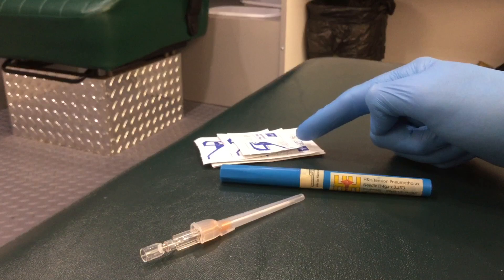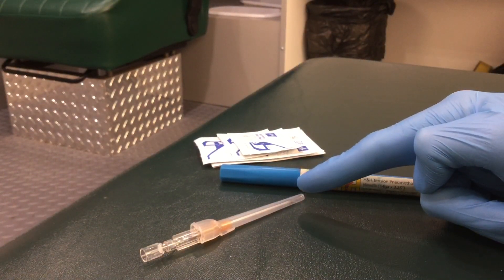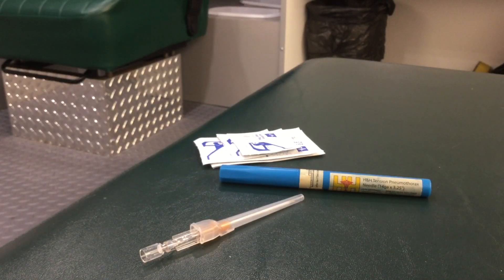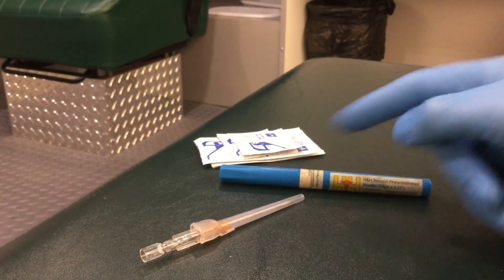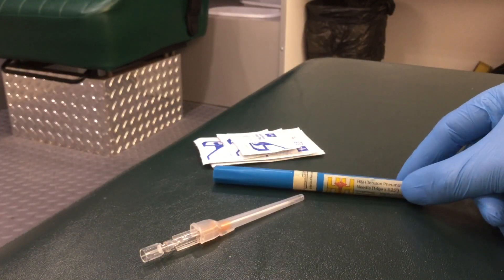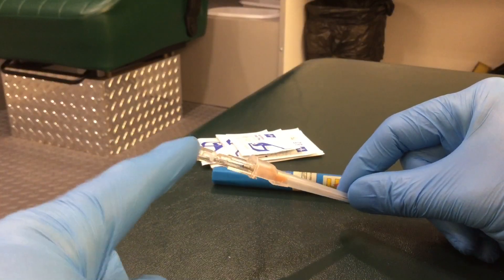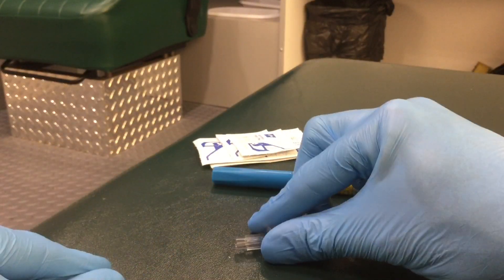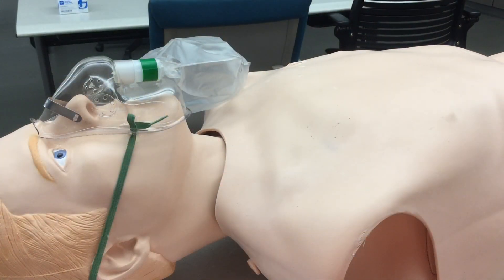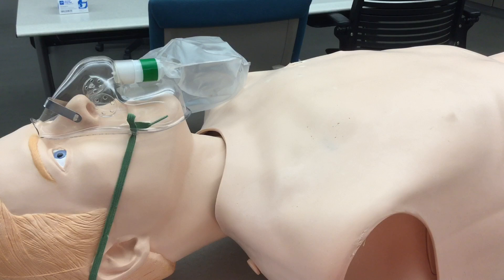The equipment needed is a cleansing solution such as betadine or an alcohol prep, and a 10 to 14 gauge IV catheter that is three and a quarter inches in length for an adult. You can use commercially made devices such as the ARS needle, or a standard 10 to 14 gauge IV catheter. If using an IV catheter, make sure it has an air filter that can be removed, so when you puncture the thoracic cavity you can allow the air to escape.